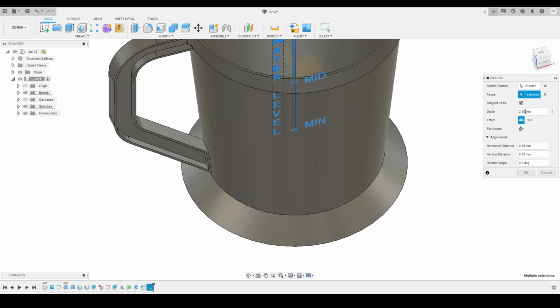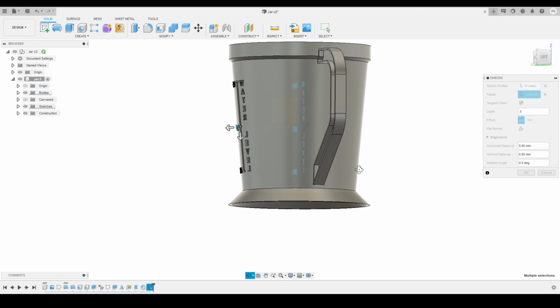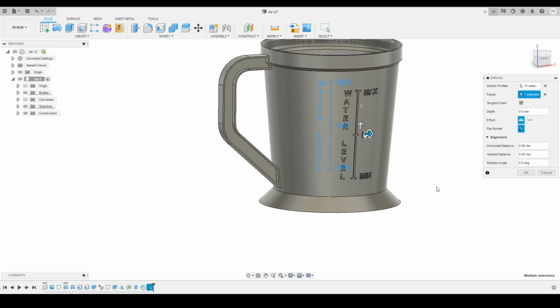So before that I will change the distance over here. I just want to keep it as maybe minus 0.1 millimeter, and I had to change the alignment. I think it is going on the back side. I just had to flip this to the other side, so I will click here to flip normal, and now it will project on the other side of our body once I click on flip normal. So here you can see it has just taken a few seconds, and now it is projecting on the right side. And now if I press OK, I will get the final result.